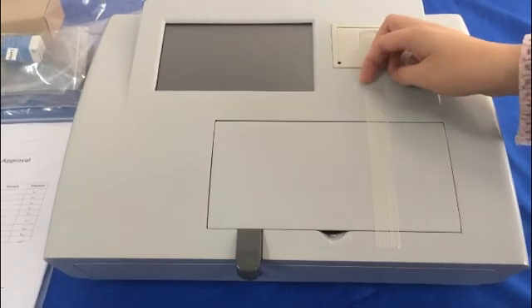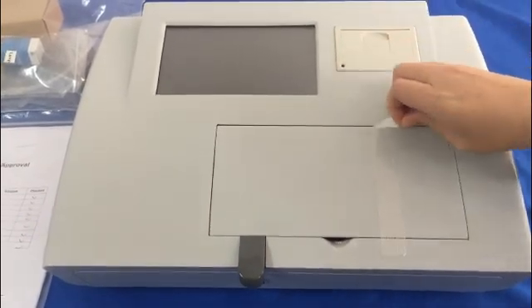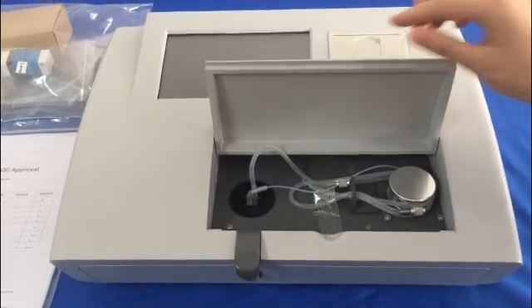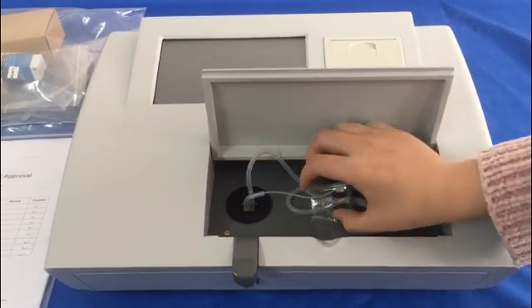Tear off this tab. Open this panel. And also tear off this white tab.